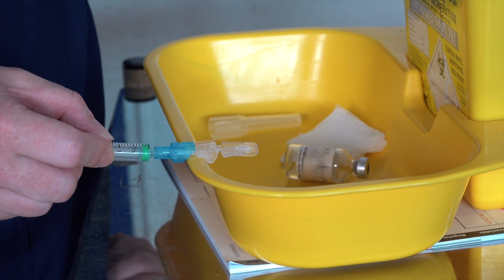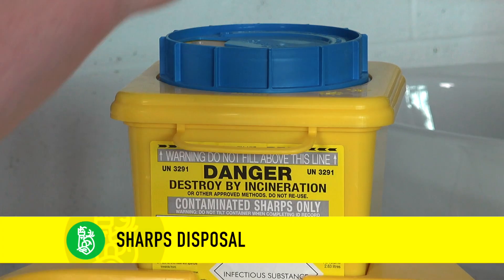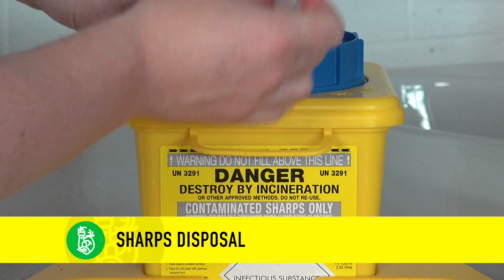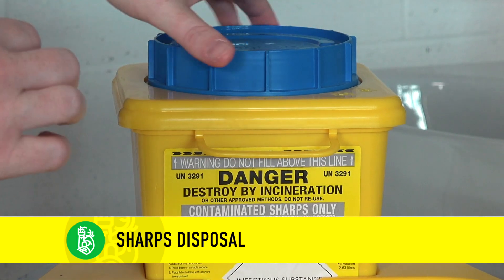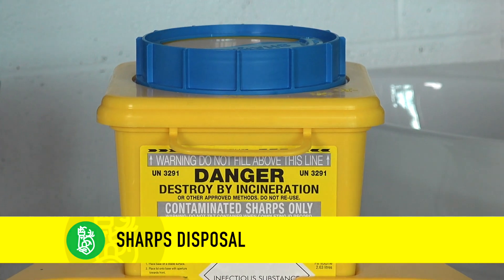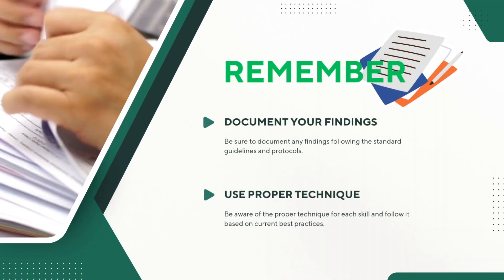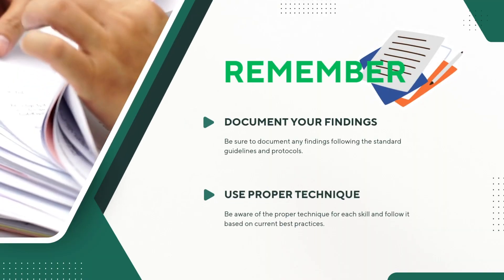Dispose of sharps directly into the sharps bin according to local policy. Carry out hand hygiene. Monitor the patient for any effects of the prescribed medicine and any problems with the injection site.